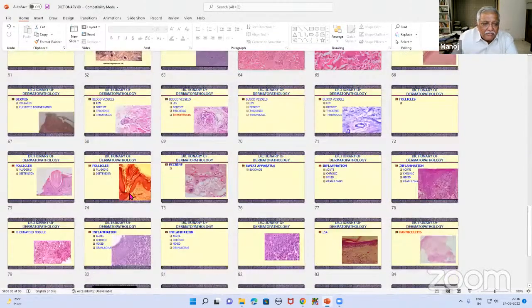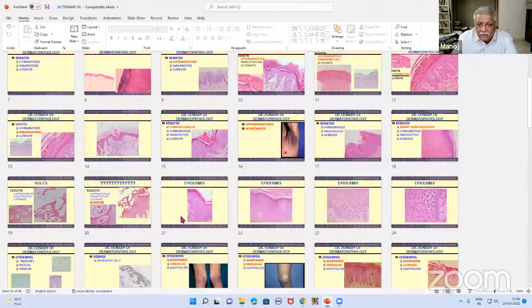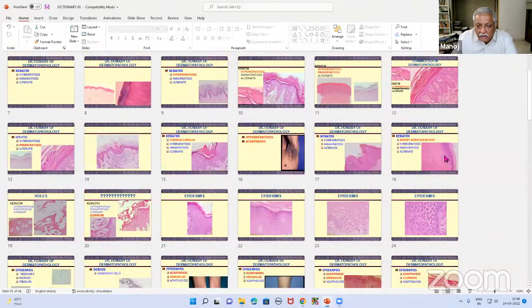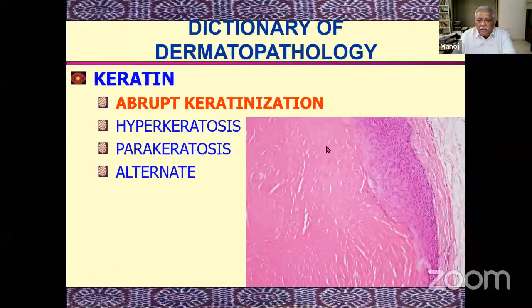lining in it. Let me just see. We had that cyst somewhere, didn't we? Where was that? Okay, there you are. Now, I ask you, hold your hand like this, right? Hide the keratin. What is the cytological difference between this normal skin and epidermal inclusion cyst?